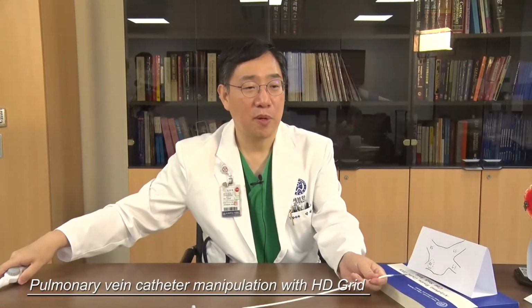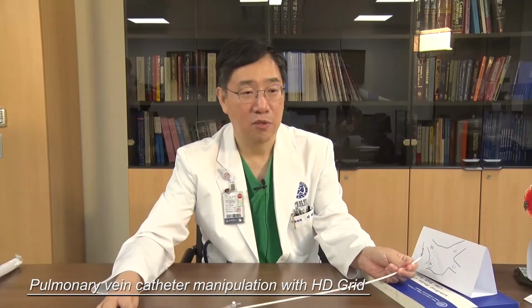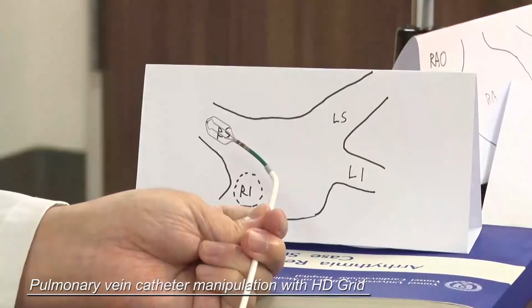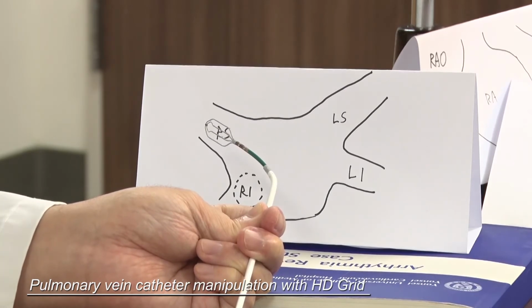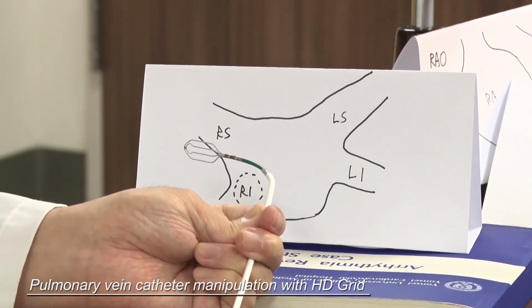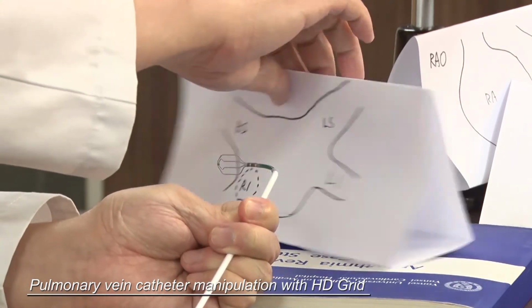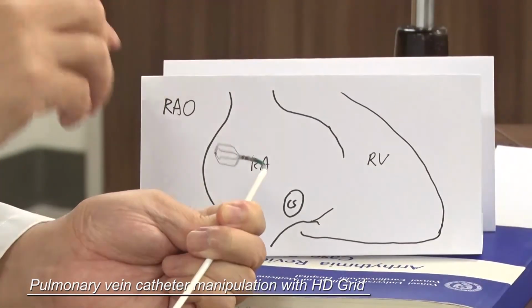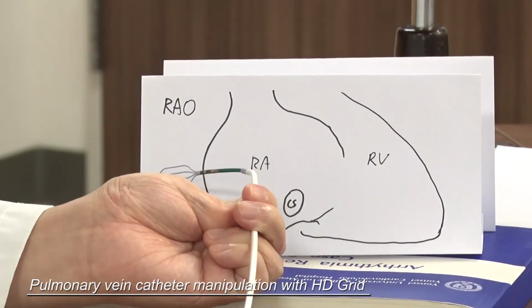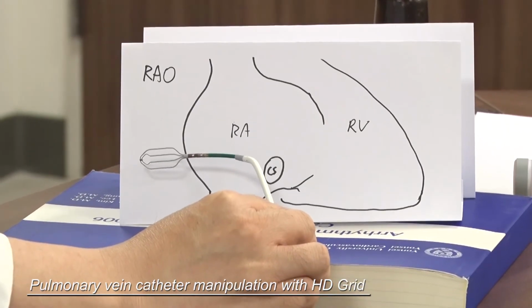Okay, from the right superior pulmonary vein to the right inferior pulmonary vein, imagine where the patient's right inferior pulmonary vein is located. It is more posteriorly directed. So if you want to move your catheter in a posterior direction from the right superior pulmonary vein to the inferior vein, deflect down, apply counterclockwise torque and direct posteriorly, and then move your fluoroscopy to the RAO view, and you can see where your catheter position is, with the tip directed to the right inferior pulmonary vein.